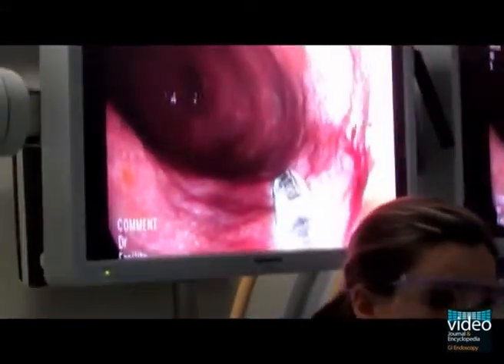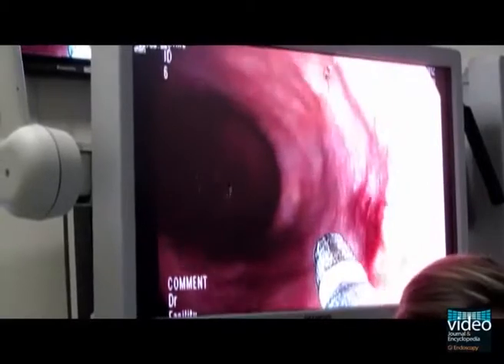Here is a long segment Barrett's esophagus with a circumscript lesion that is about to be examined in detail with confocal endomicroscopy.